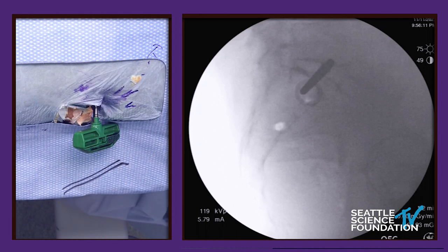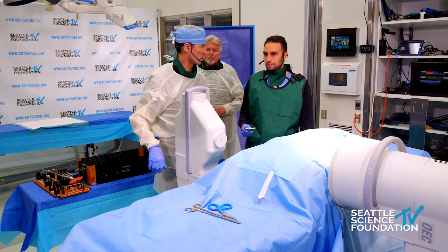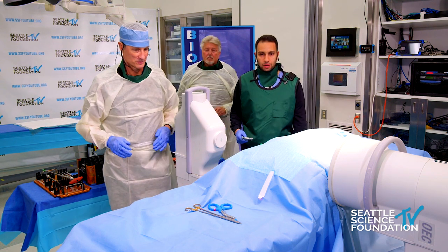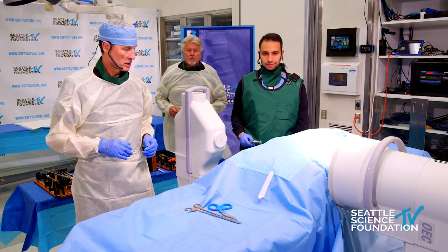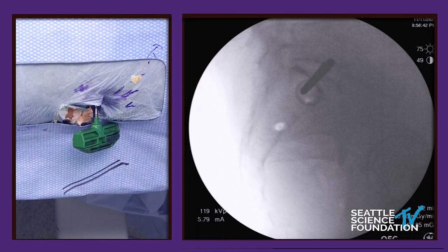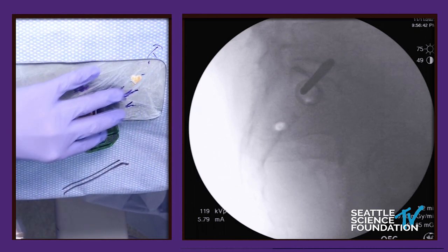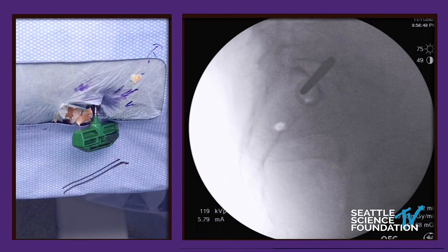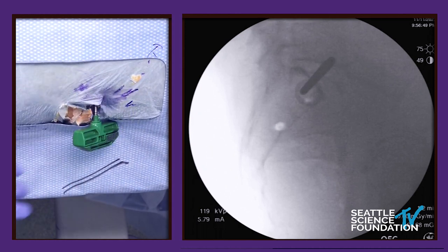Let me introduce Rami — he's a fellow. Before you start hammering, can you introduce yourself to the audience? Sure, I'm Rami, I'm a pain fellow at University of Washington, Seattle. Great. We're just going to go ahead and give it a couple of taps right there. You can hear the change in tone as it goes through the SI joint — it's much harder than the surrounding ilium.